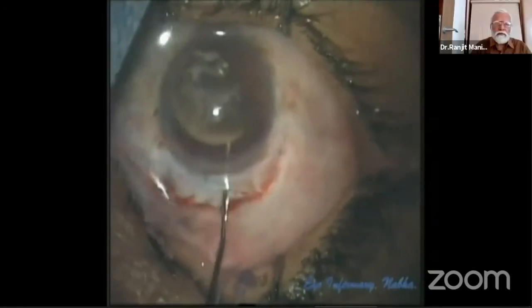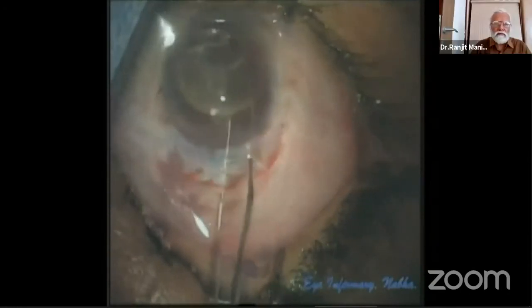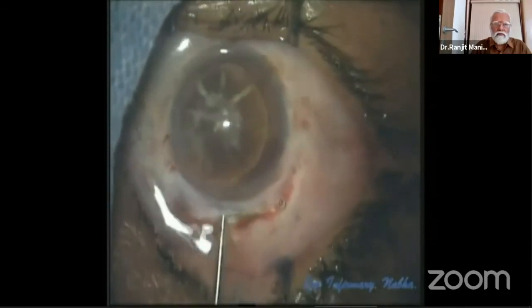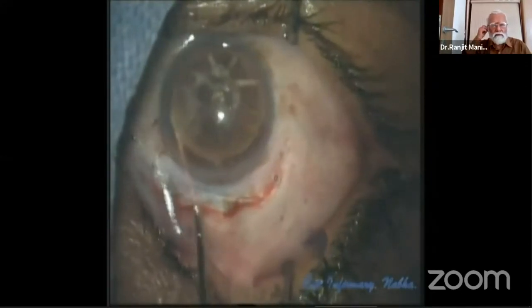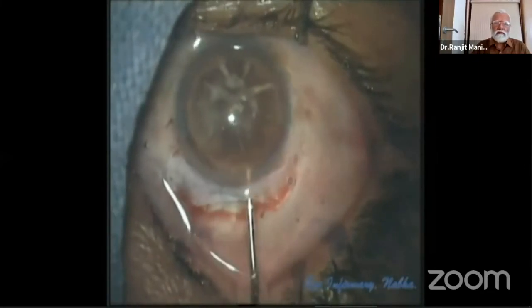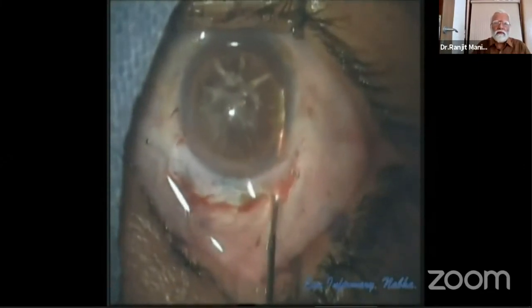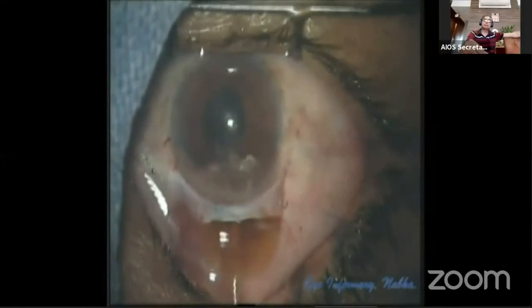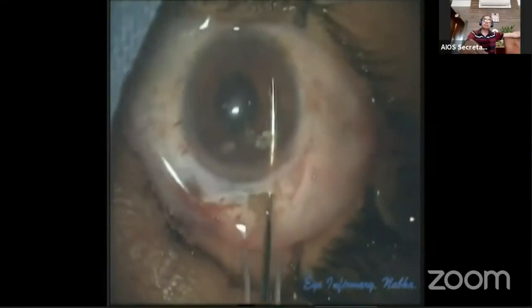At this stage we shift to a visco cannula. Visco does not let the AC collapse and has a cushioning effect on the PC as the nucleus is prolapsed out of the bag. The nucleus is delivered by visco expression, which reduces repeated entry of instruments into the chamber and doesn't allow the AC to collapse at any step.